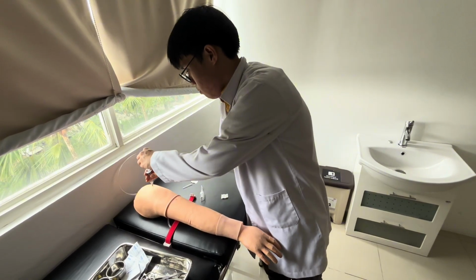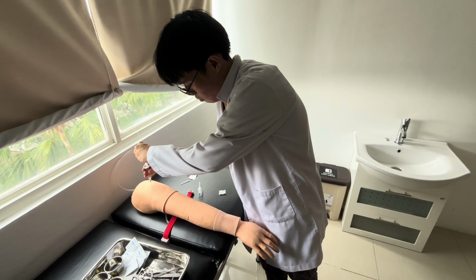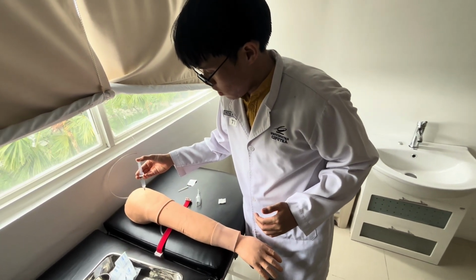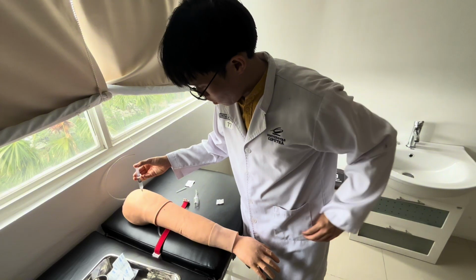And then you perform aspiration to make sure you don't hit a blood vessel. And if there's no blood, then you can go through with it. So you inject the medicine slowly.